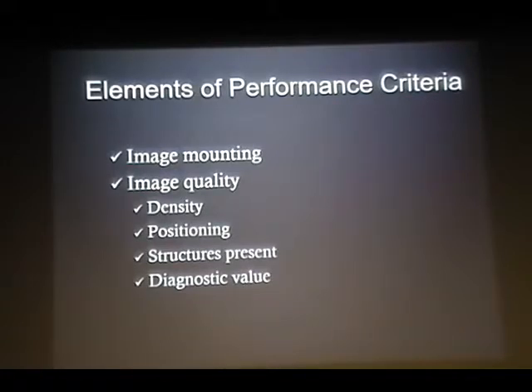So, image quality. What are the things that I look for? Density. You guys are familiar with density, right? Yes.